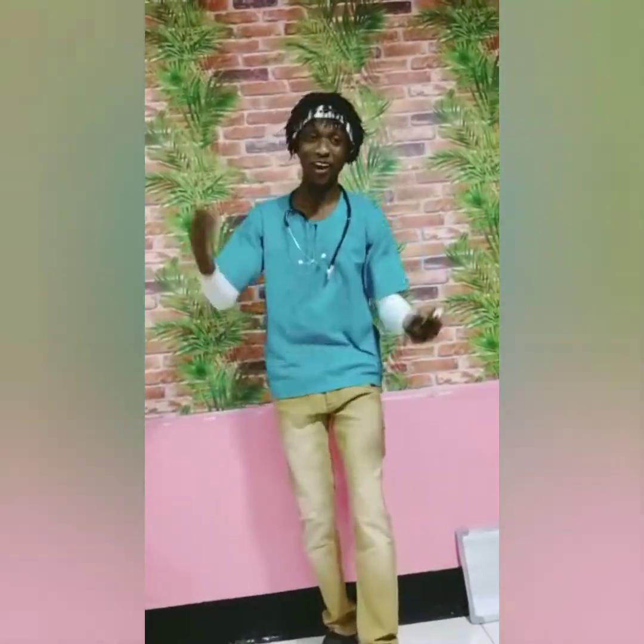Vital signs can also be called cardinal signs. Vital signs represent physiological statistics of a patient. I'm talking about your height, your weight, body temperature, pulse, respiration and blood pressure. In this video I want to focus on blood pressure.